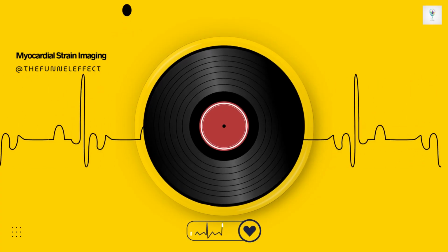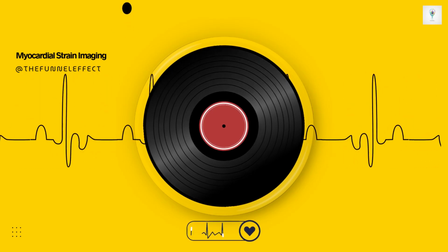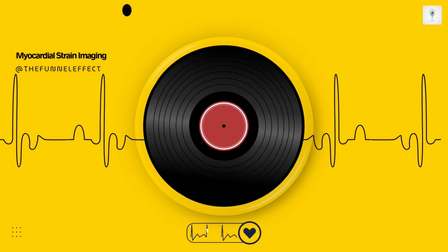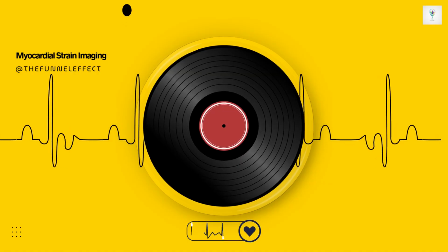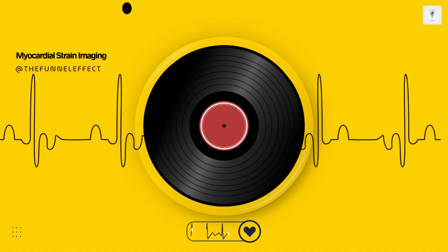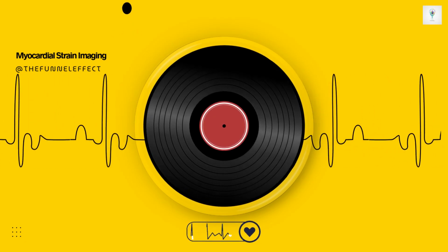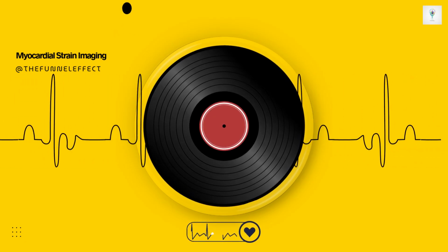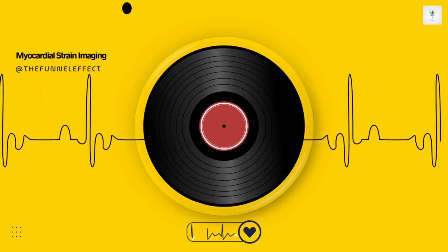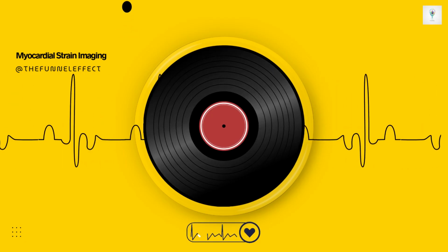The strain values in the basal and mid segments of the LV are severely reduced, very poor contraction due to the heavy amyloid infiltration. But, for reasons not fully understood, the strain at the very apex, the bottom tip of the heart, is relatively preserved or spared. So you see this clear gradient from poor function at the base to better function at the apex. Exactly. This distinct base to apex gradient is a powerful diagnostic clue, highly specific for amyloidosis.